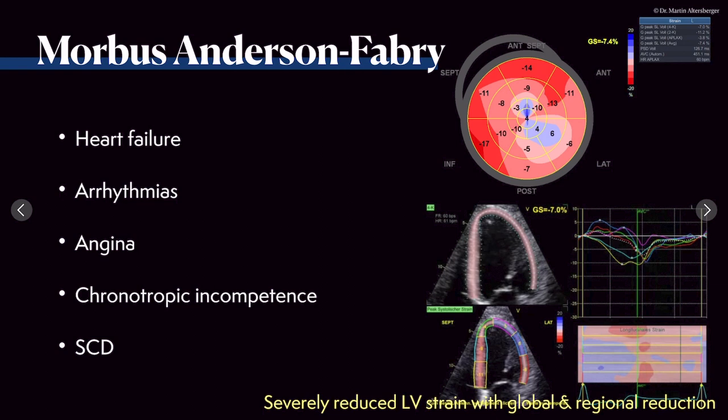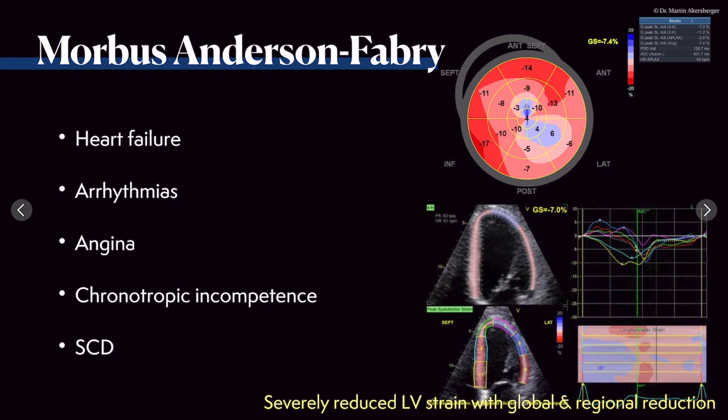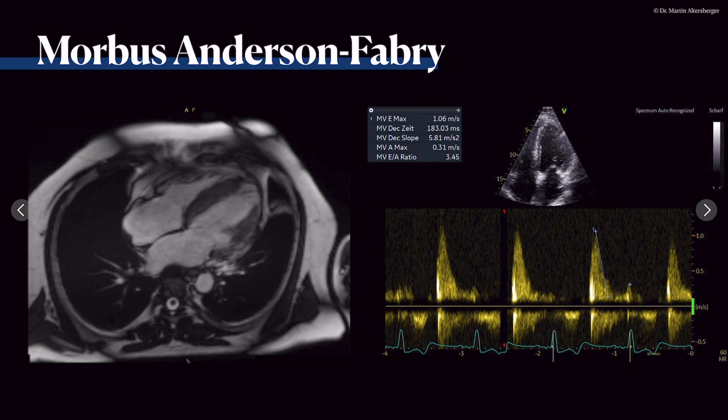These patients are at risk and can have specific therapy — enzyme replacement therapy — but of course we have to perform genetic testing. Here the bullseye display shows quite nicely the basal segments and the reduction in strain in the apical segments, especially in the lateral and inferolateral region where we also visualized possible scarring of the left heart.